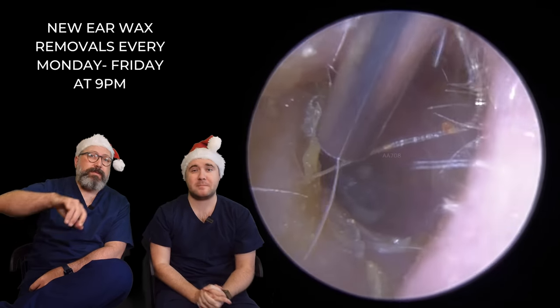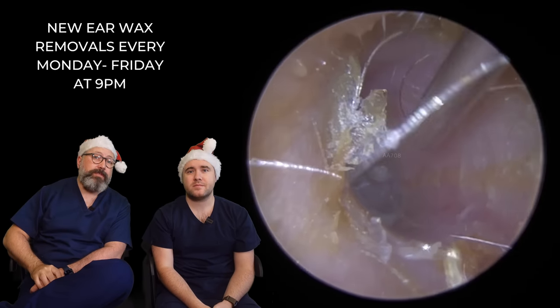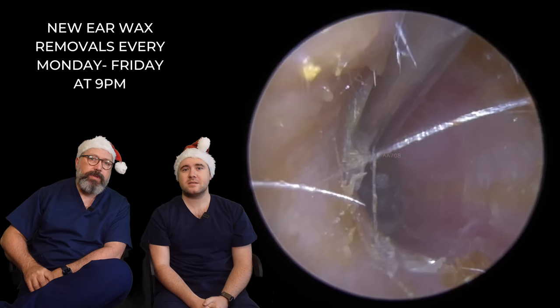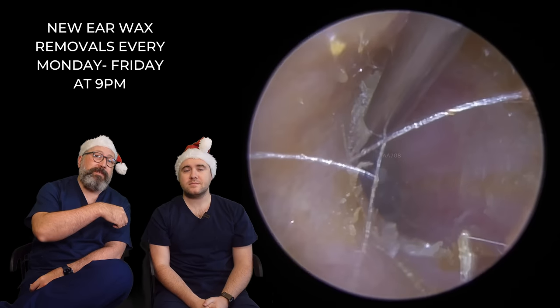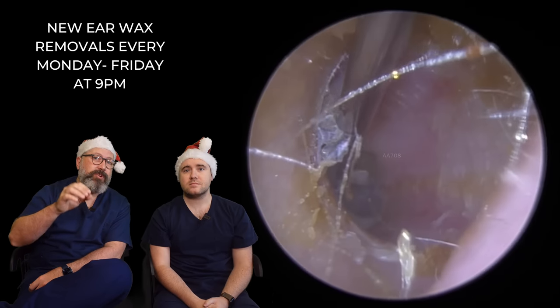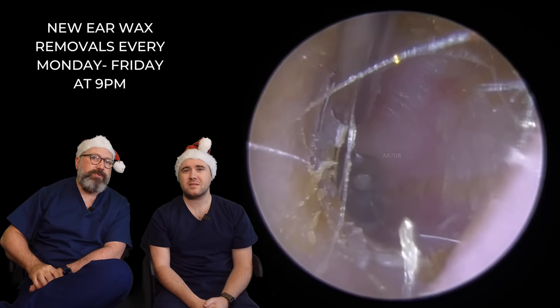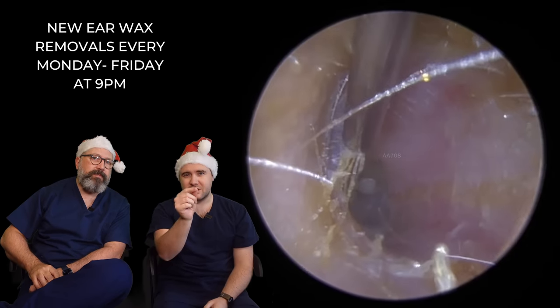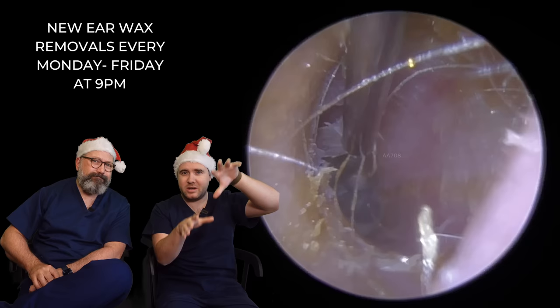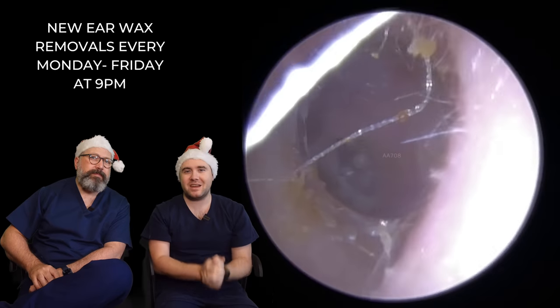Just tidying up what looks like dead skin that we could see - this is obviously where it detached from the canal wall. It would have wrapped around that one edge of the dome. We were talking just last video about this very thin type of skin that doesn't want to come away easily. You try and peel it along until you get a bit of resistance and that's where you tear it off, because that's where it's still attached quite firmly to the fresher skin underneath. You can see it's starting to tear away there, with little holes at the back. It's quite tricky when they start splitting apart like this, but we've managed to get that away quite nicely.